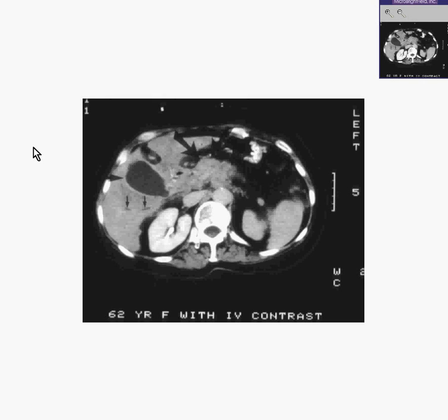Here is another case, which will start out by showing an abdominal CT scan in which the arrows are pointing to areas in the liver which are not only translucent, but they are sausage-shaped. They can perhaps be dilated ducts rather than generally circular metastatic areas. In addition, with this being the left lobe of the liver, and this perhaps being the gallbladder fossa, and this being the spleen, and probably most of this being the stomach, the pancreas is generally irregular and denser than it normally should be.